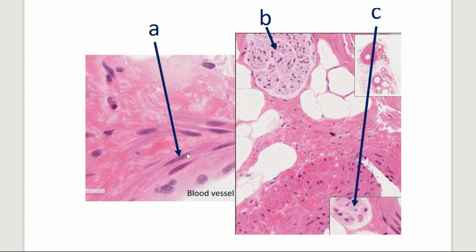And then you see how this nucleus is bigger, right? It's not as condensed as this cell right here or this cell right here. The nucleus is bigger. It's this kind of nice round shape. So this is actually smooth muscle, okay? Because all this pink stuff around it is actually within the cell. Whereas over here, this fibroblast, that's the whole cell, and all the pink stuff around it is that collagen, okay? So this is actually a smooth muscle cell right here.